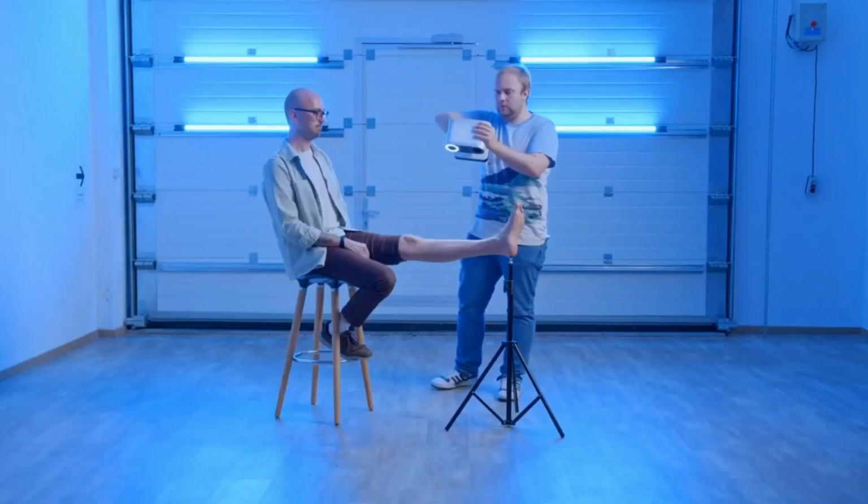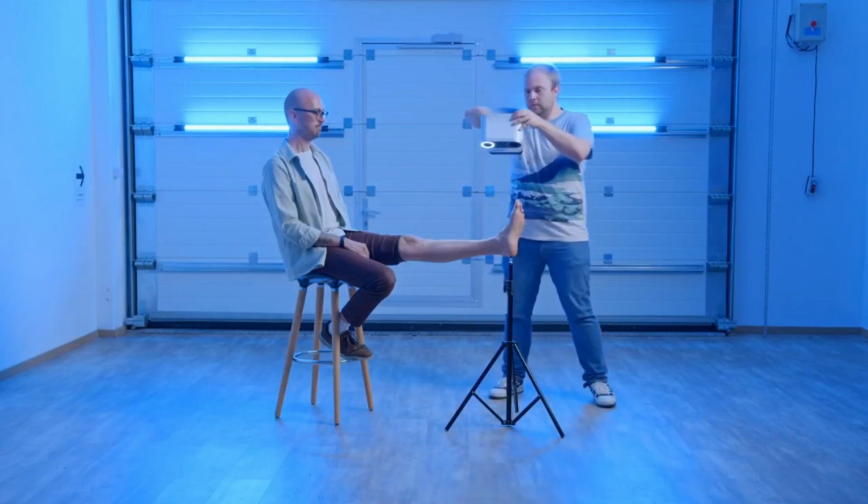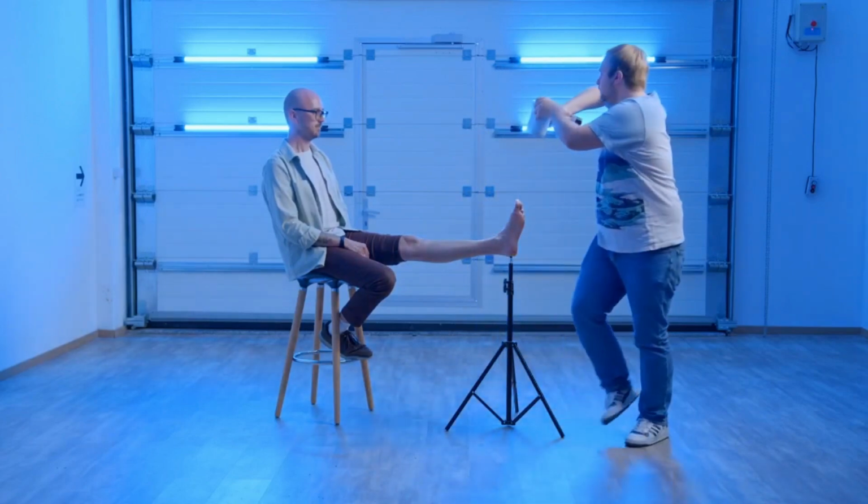People with some medical conditions are not allowed to put weight on their foot, and therefore the leg needs to be scanned unloaded. And in that case, sometimes tracking is lost due to the lack of surface in the field of view. That can be solved with a wisely chosen scanning angle. So here we start from the knee, then move down to the toes.